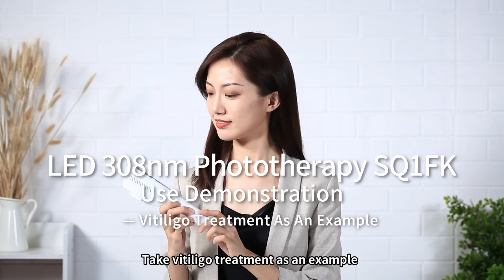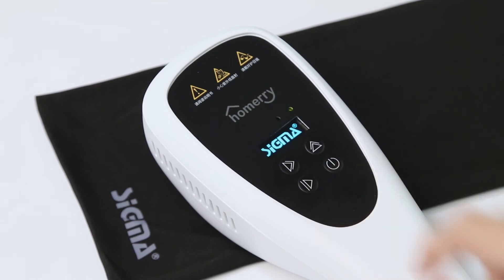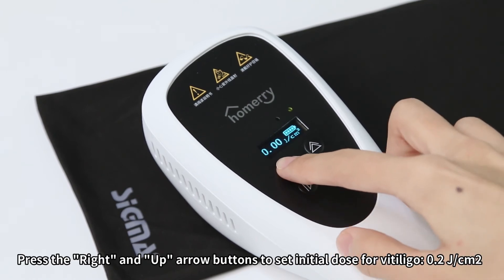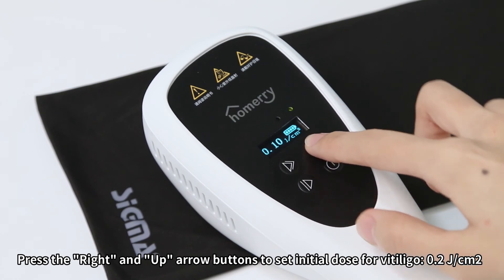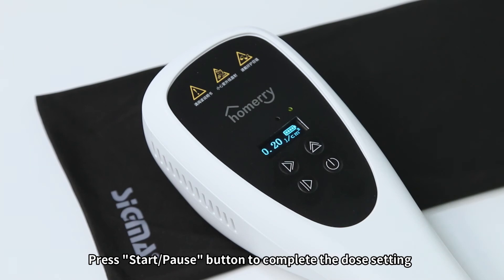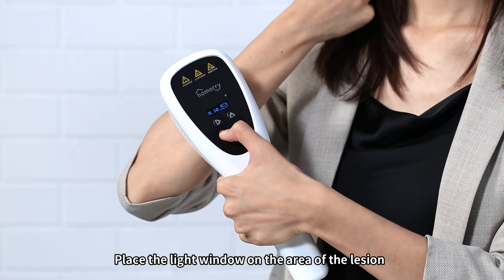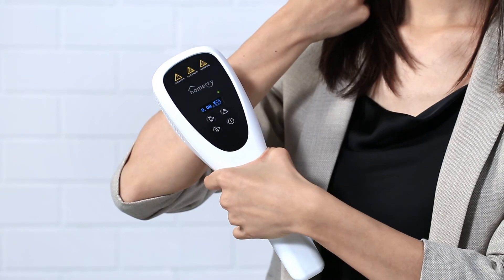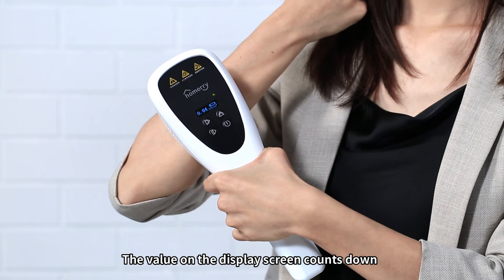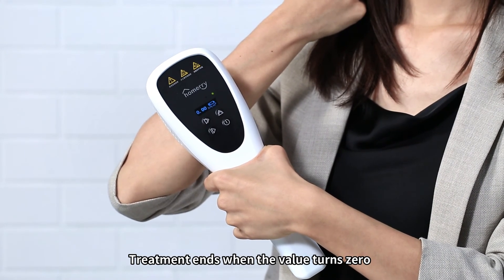Taking Vitiligo treatment as an example: turn on the device. Press the Right and Up Arrow Buttons to set the initial dose for Vitiligo at 0.2 J/cm². Press the Start/Pause Button to complete the dose setting. Wear UV goggles for eye protection. Place the light window on the area of the lesion, then press Start/Pause to begin. The display screen counts down and treatment ends when the value reaches 0.